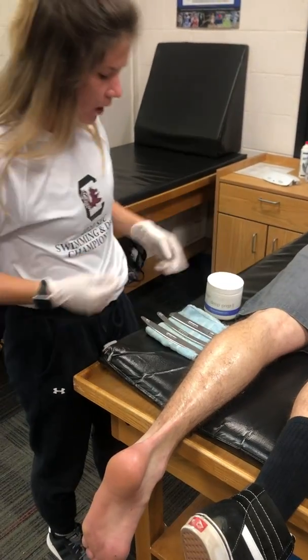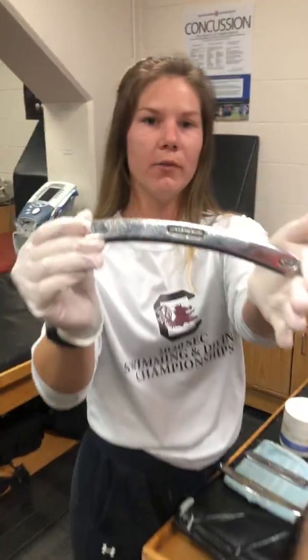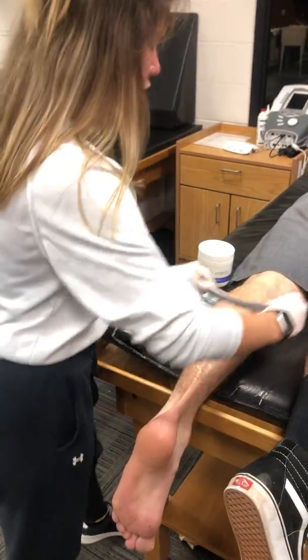The first tool I'm going to use is the GT5. This is more of a scanner tool. You'll want to keep it on the face and use the beveled edge, going in one direction and scanning the area for any crepitus, grittiness, or muscle tightness.